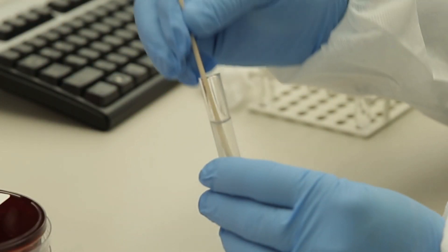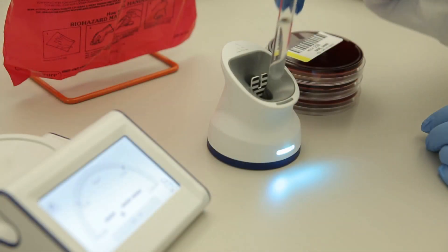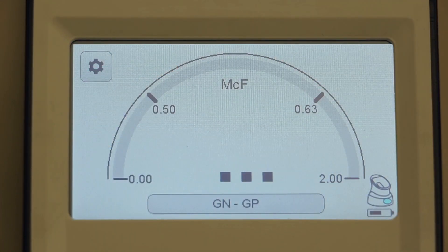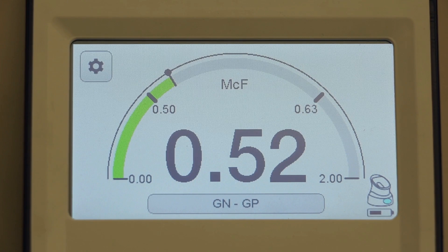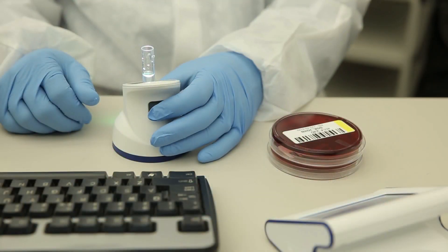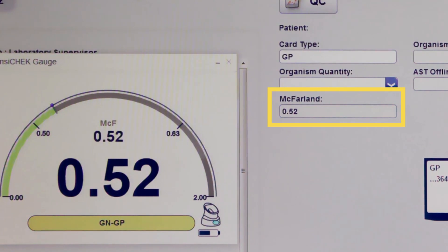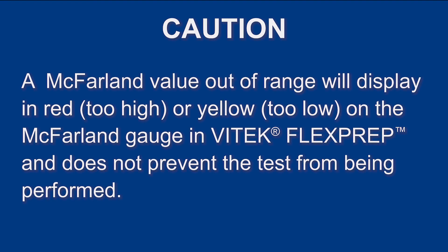If necessary, adjust the suspension and repeat the measuring process until the McFarland meter gauge is green and the value is within the appropriate range. Press the button on the back of the pod to accept the McFarland value and send it to Vitek FlexPrep. A McFarland value out of range will display in red (too high) or yellow (too low) on the McFarland gauge in Vitek FlexPrep, but does not prevent the test from being performed.